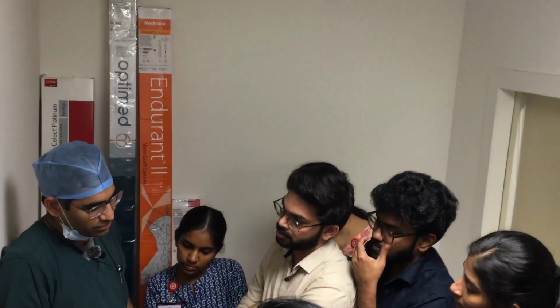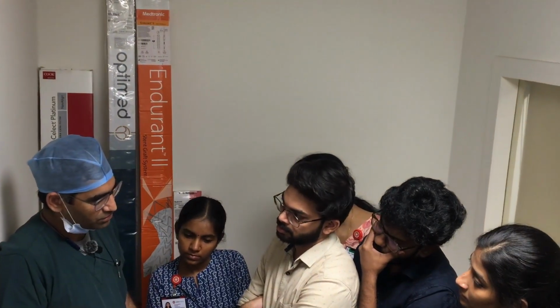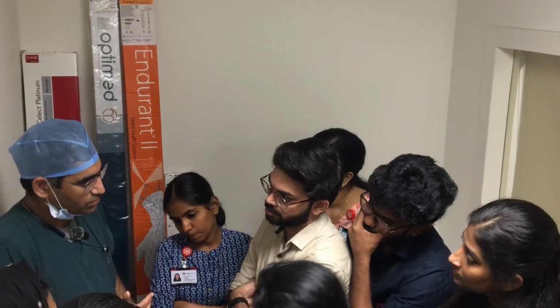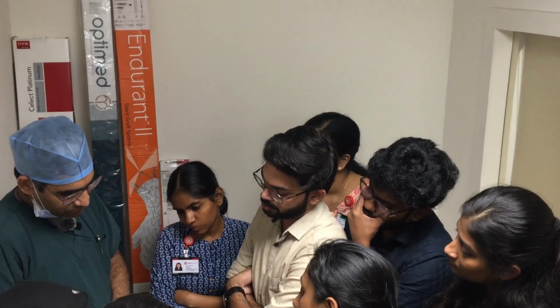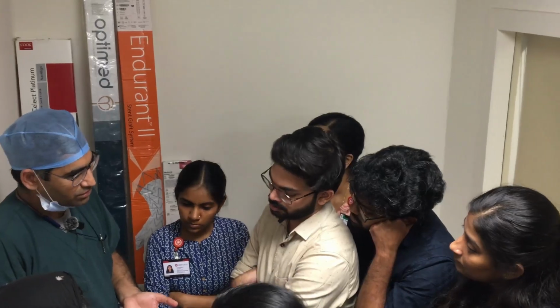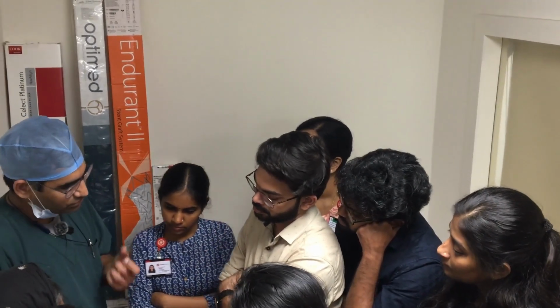So when you see a lesion, you have to plan it. What balloon am I going to use? What sheath will be required? And so on. That planning has to go on. What material you have, what sheath you have to use, what is the length of the balloon. If it is 135 and the lesion is farther, then you won't be able to use it. Then the diameter of the balloon.